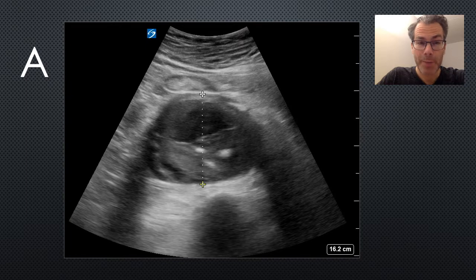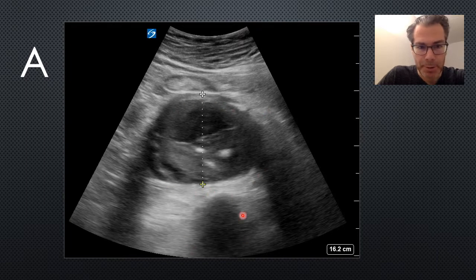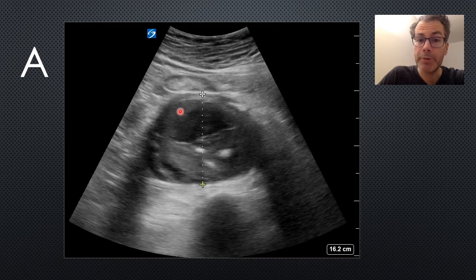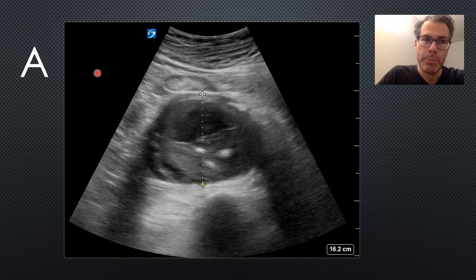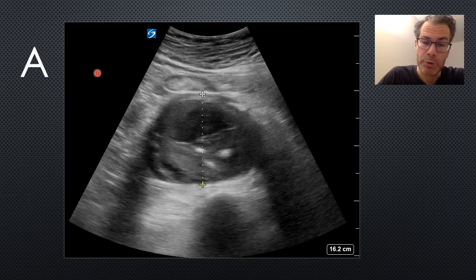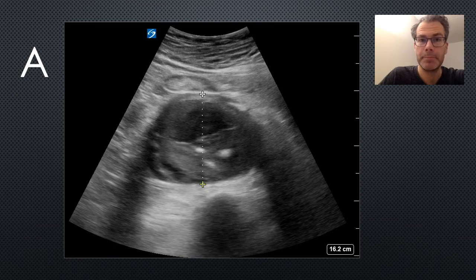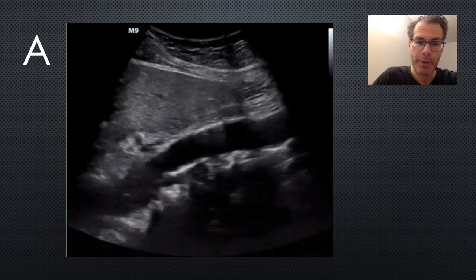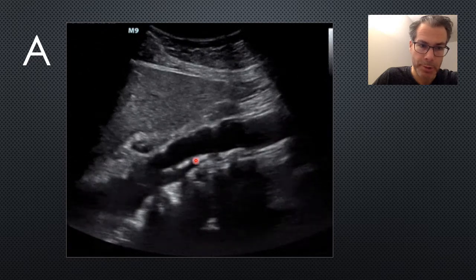The fourth part of HI-MAP is A for aorta. Here is a clear example of a large AAA — vertebral body at the back and the dilated aorta in front. Always include any intramural thrombus in your measurement or you'll massively underestimate its diameter. Finding a triple-A doesn't confirm rupture, but a patient in shock with no other obvious cause and a large AAA should ring alarm bells. If stable, a contrast CT can confirm leakage. Also watch for dissection flaps — here's a longitudinal view showing one clearly.